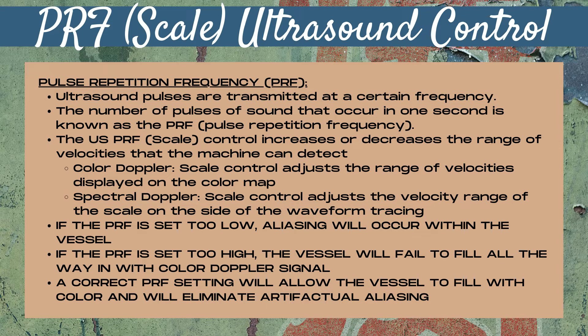When the PRF control is set too high, the vessel is going to fail to fill all the way in with a color doppler signal. A correct PRF or scale setting will allow the vessel to fill with color and will eliminate artifactual aliasing. With spectral doppler, when the scale control is set too low the waveform is going to wrap around. If the PRF is set too high, the waveform will be very tiny and hard to visualize.